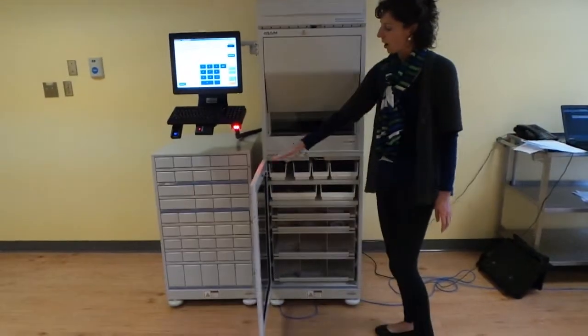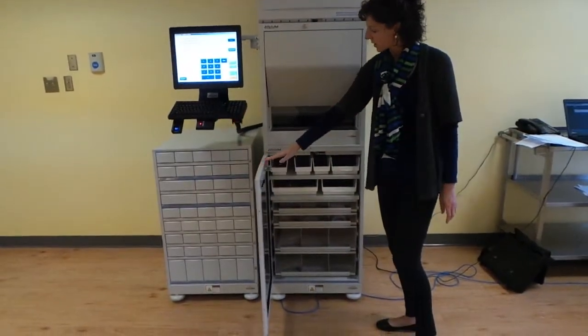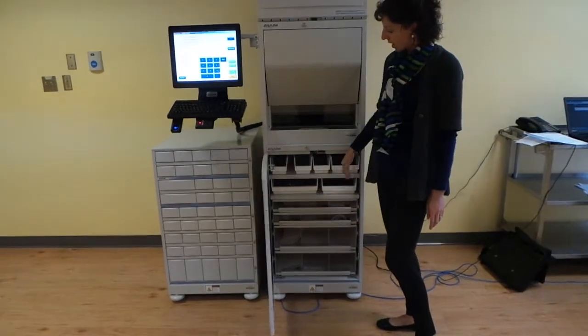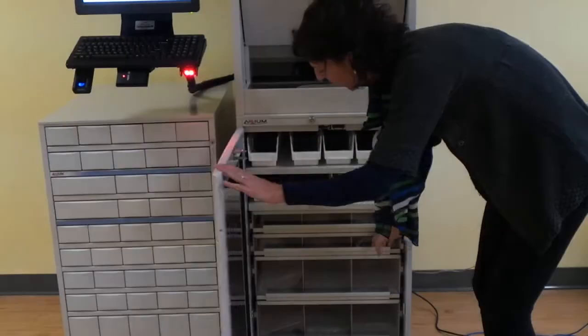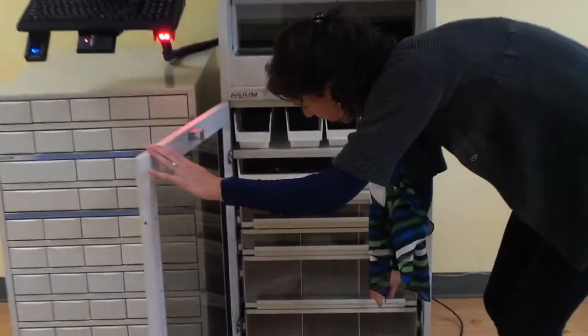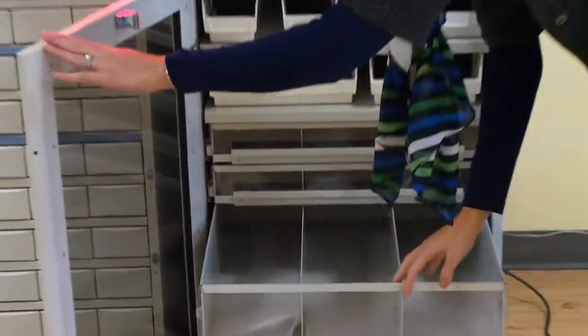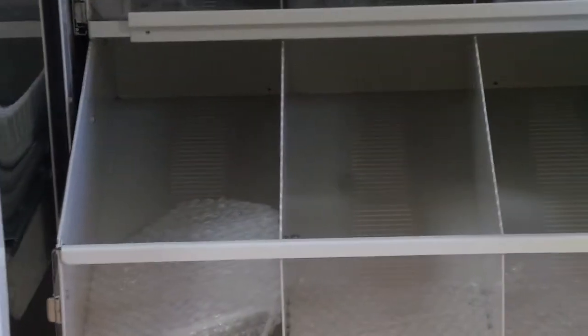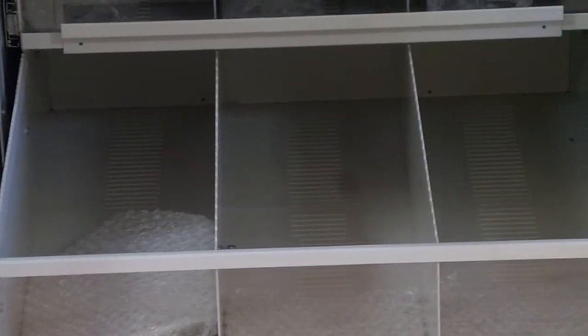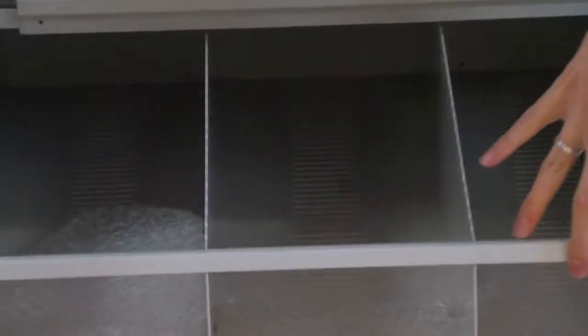Obviously, a lot less security for these items. Primarily OTC products, bulk bottles, and larger IV medications such as Flagyl, Cipro, and Avalox will be stored in these drawers here.